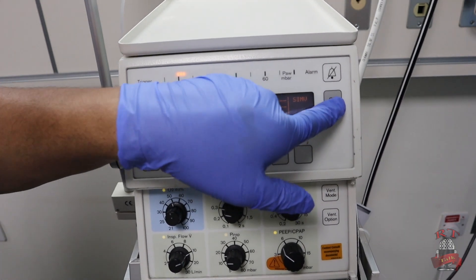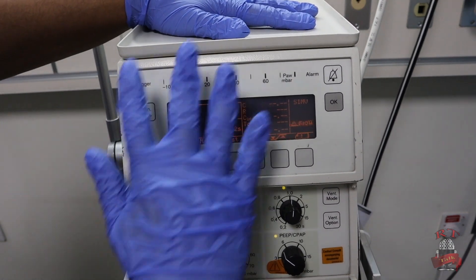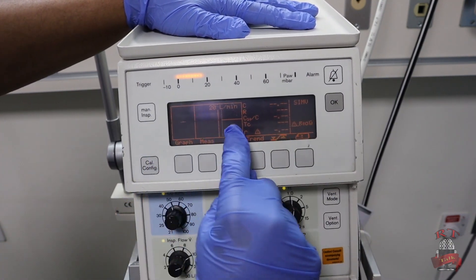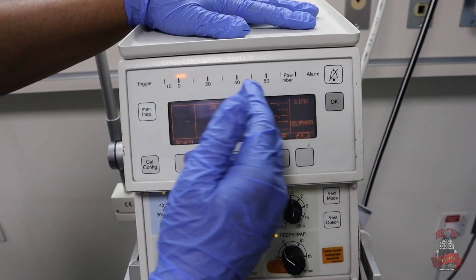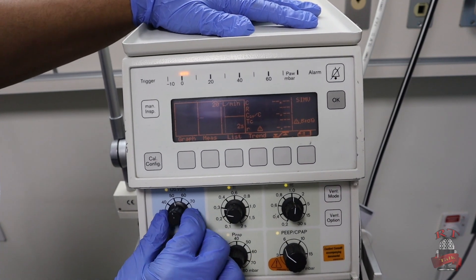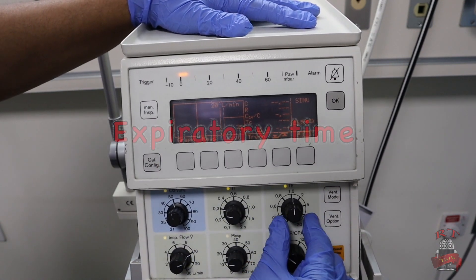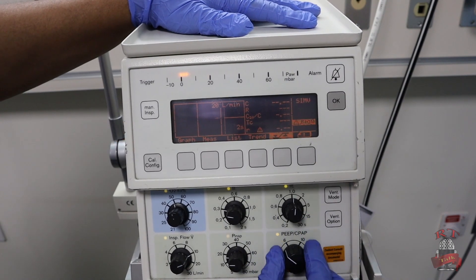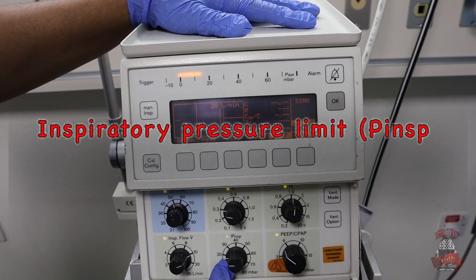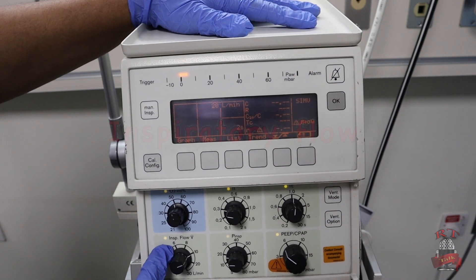We can remove all the alarms in the beginning. First we will explain the interface or the screen. Here we have our main screen — you can see your measurements, your settings, and everything. In the lower part you will find your controls: the percentage of oxygen (FiO2), your inspiratory time, your expiratory time. If you go down you will find PEEP and CPAP. On the left in the middle-down is inspiratory pressure, and in the left corner we have our inspiratory flow.